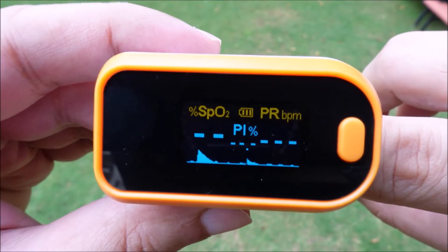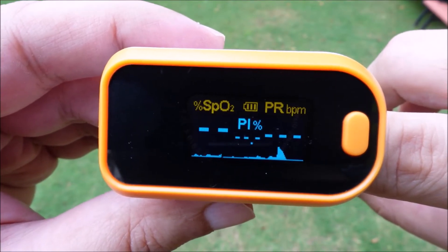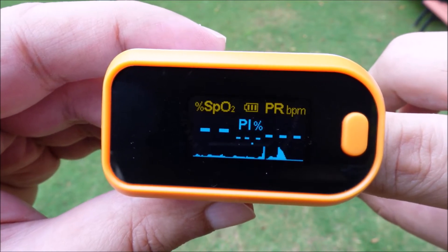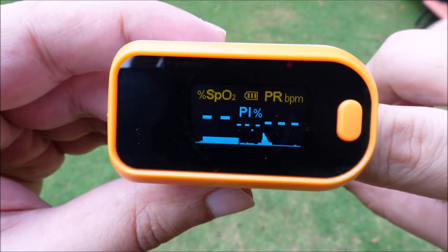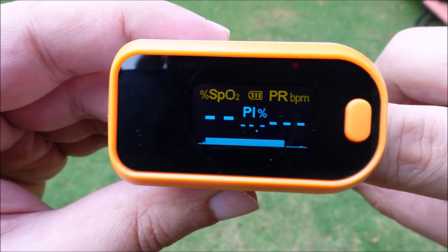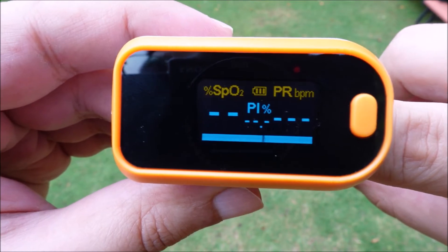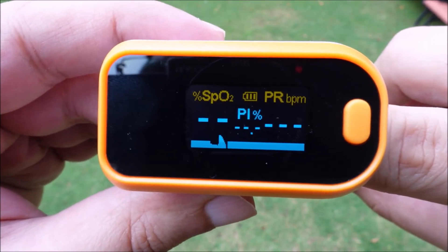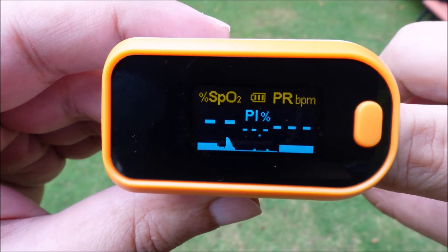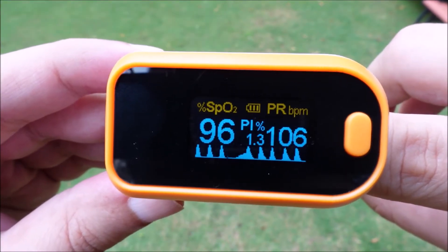Let's see the oximeter in action. Switch on the oximeter by pressing this button. Now keep your hand on a stable flat surface and insert any finger inside the machine. Keeping your hand on a stable surface will ensure an accurate reading. Don't keep moving your fingers while measuring. The machine will show the result in 10 seconds.